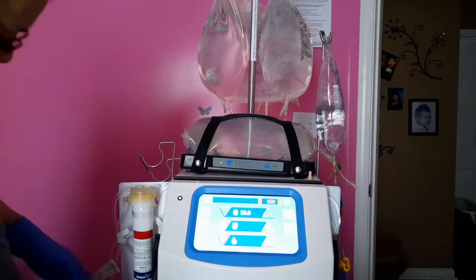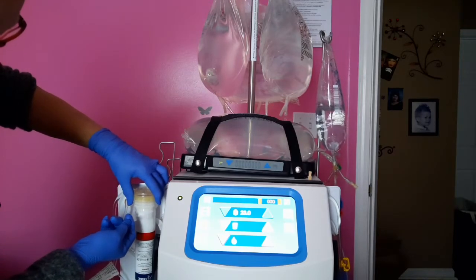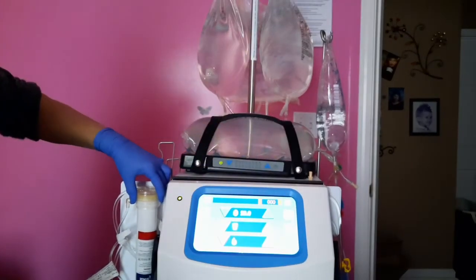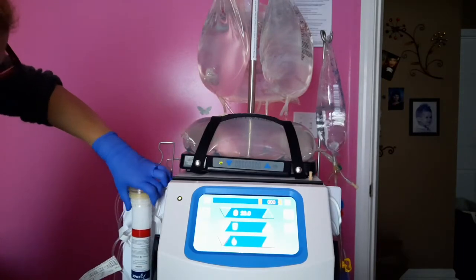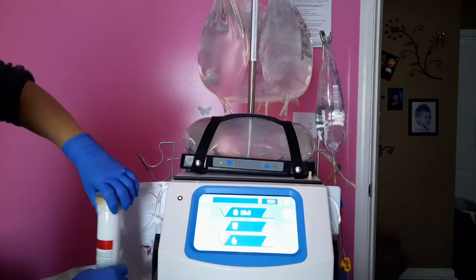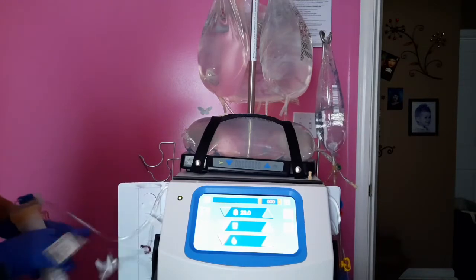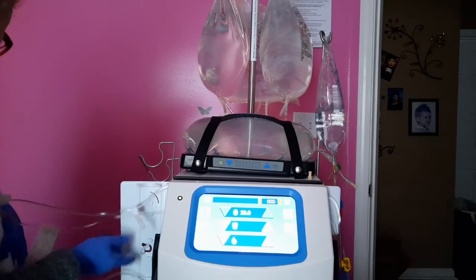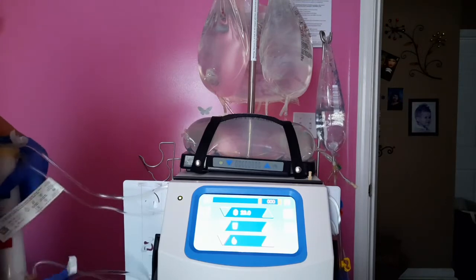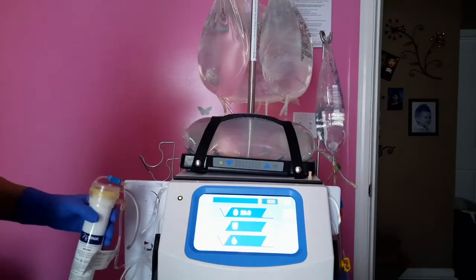Okay? Here, we need to hold on to the dialyzer. There's a little plastic band on the top. We want to pull that out. Okay, we'll take that out. This one on the bottom. Take that out. And then you pull your lines. You turn your dialyzer to where the blue clamp is now at the top. You free the lines from that little line hold over here. Then you take these tabs. These are white tabs. One, two, and there's one over here by the clamp. Three, you take them out.